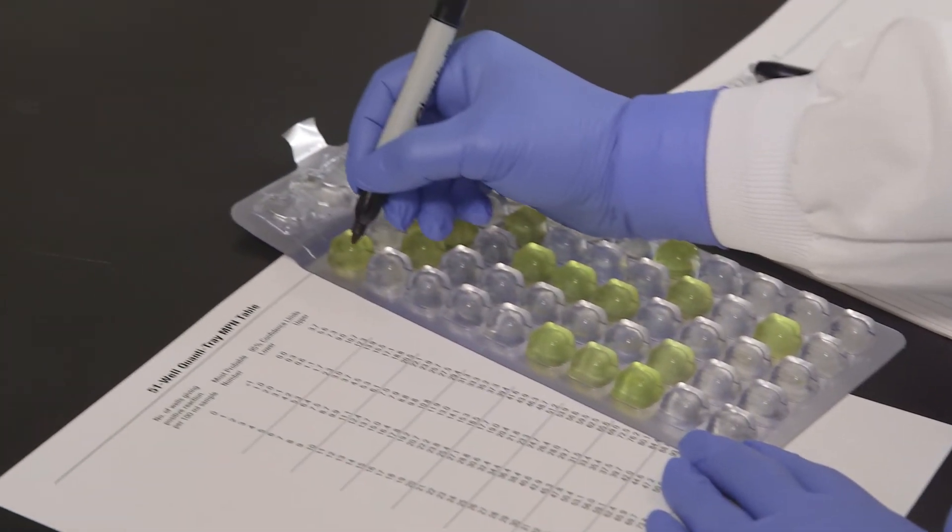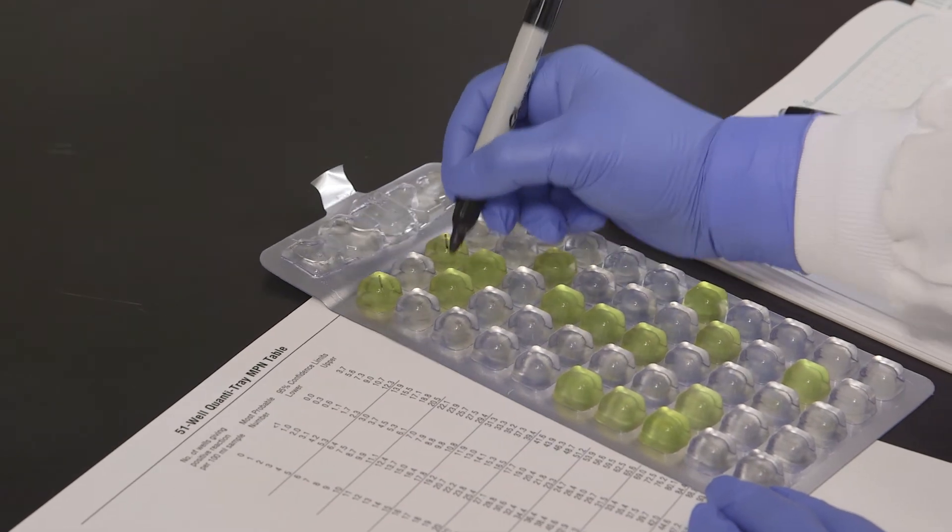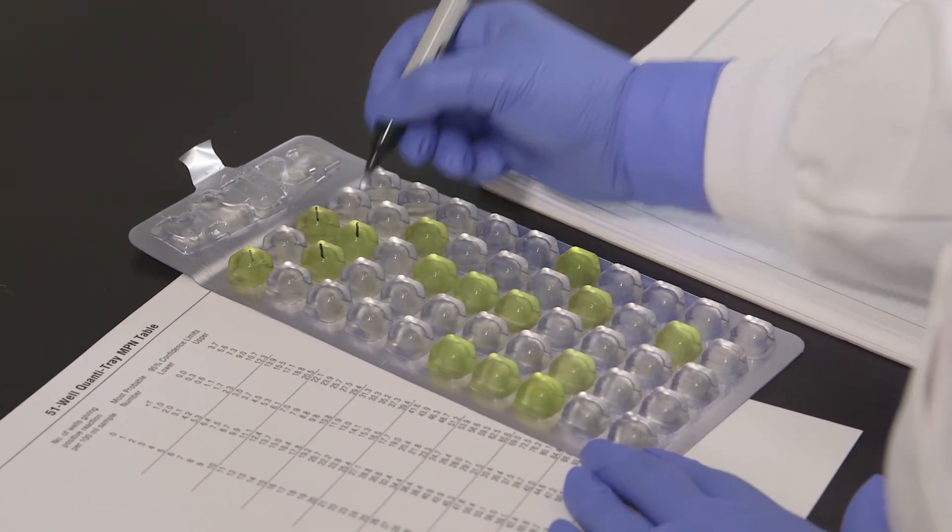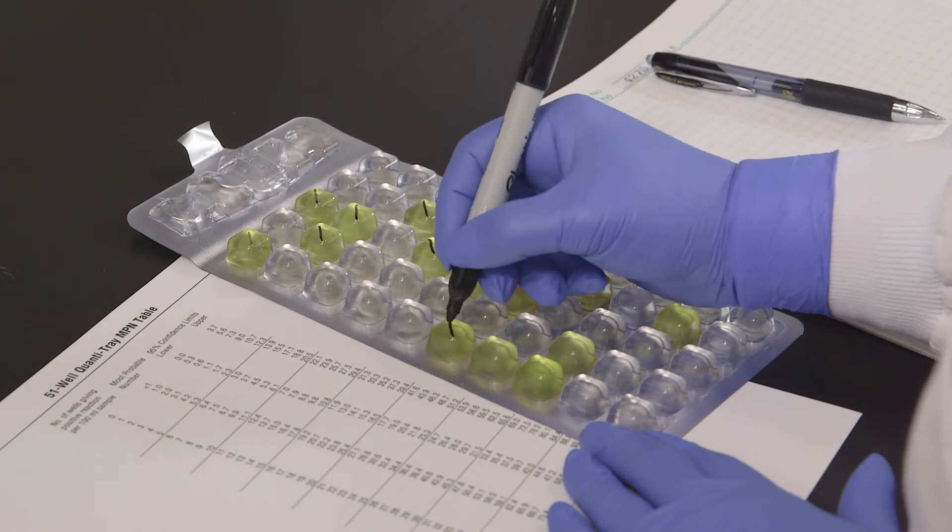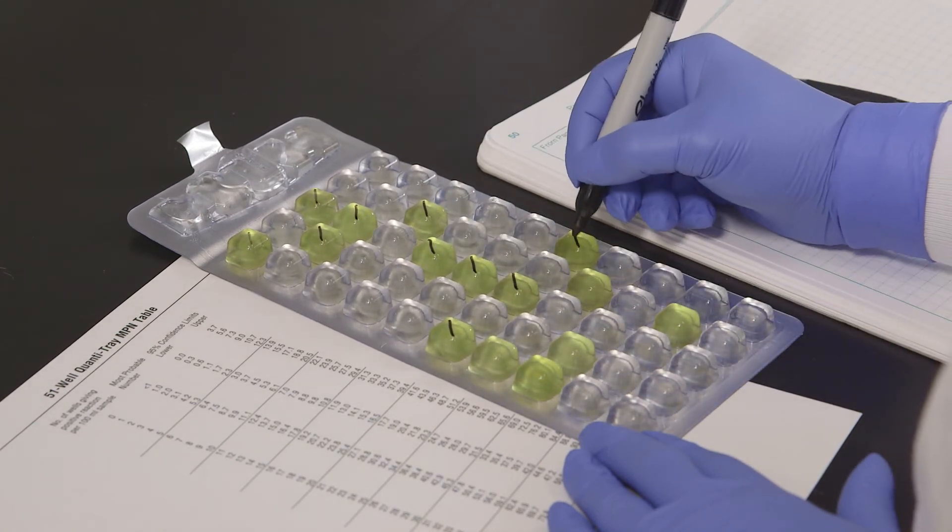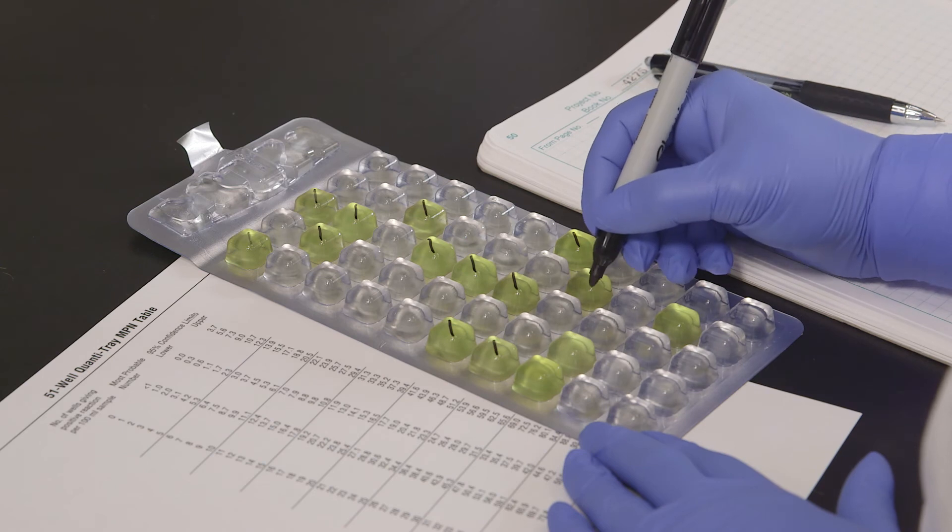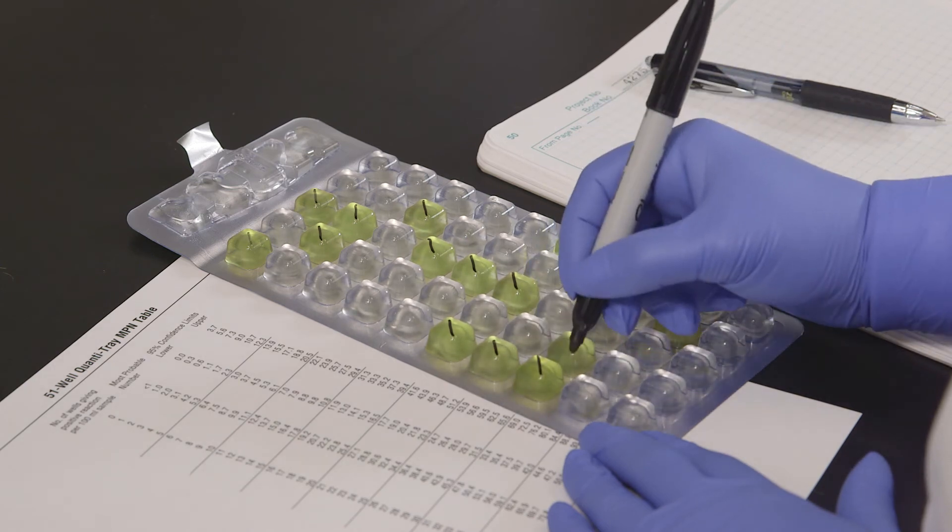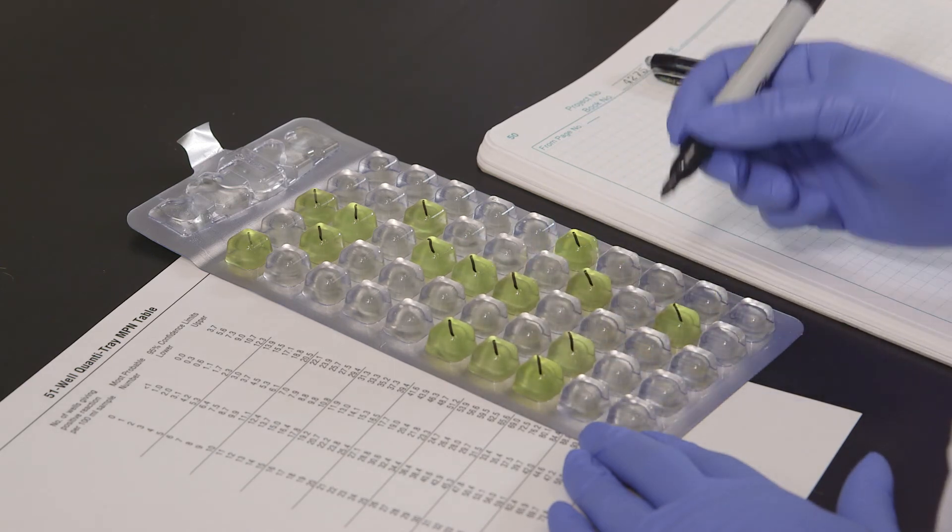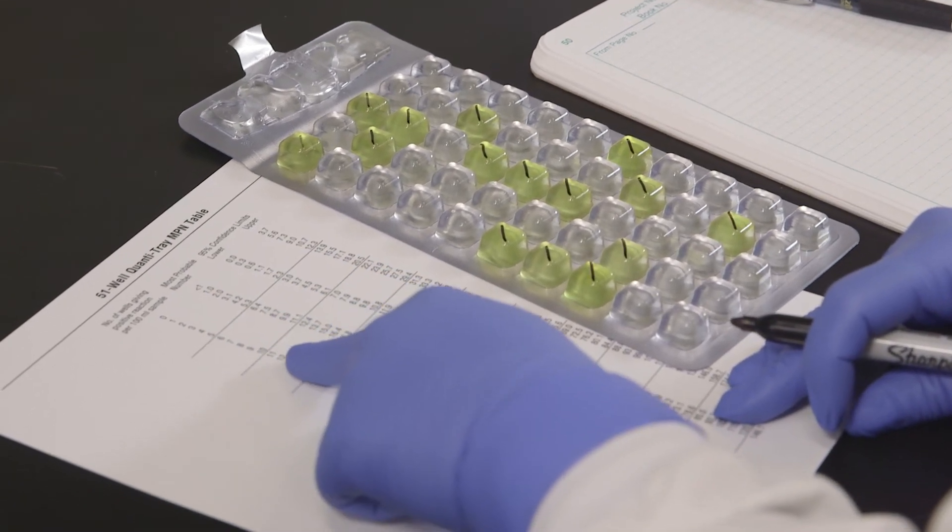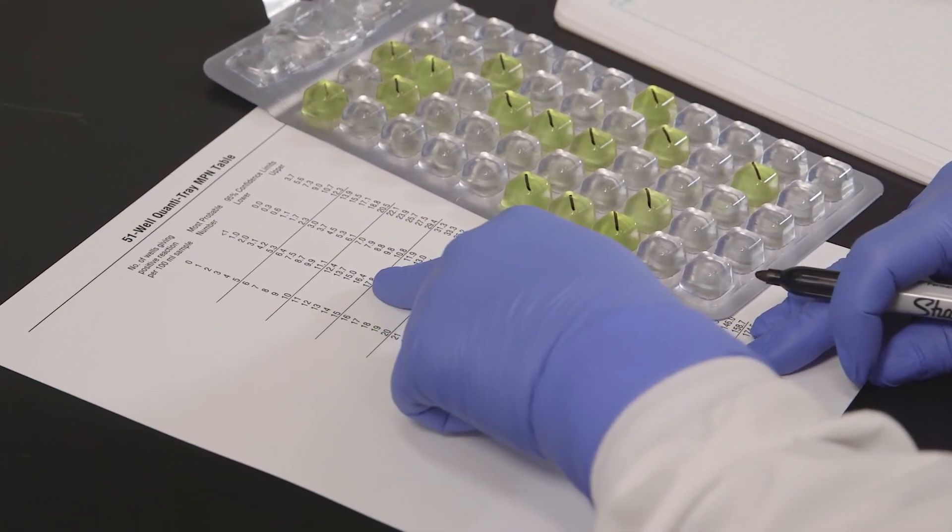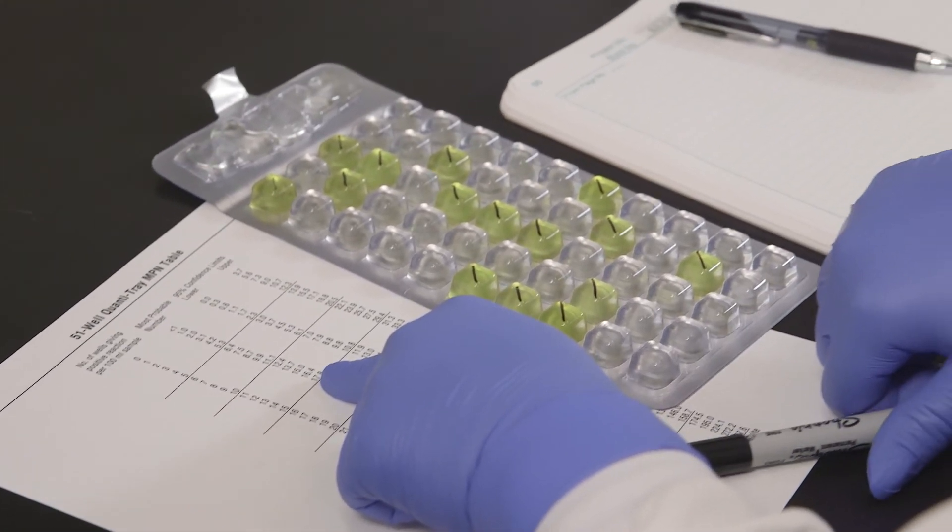After incubation mark each yellow well with a permanent marker including the large overflow well. To determine the number of total coliforms count the yellow wells that are equal to or greater than the comparator and then refer to the MPN table included with the Quantitrays. The most probable number of total coliforms for this example is 17.8 per 100ml. If using Quantitray 2000 count the overflow well as a large well.